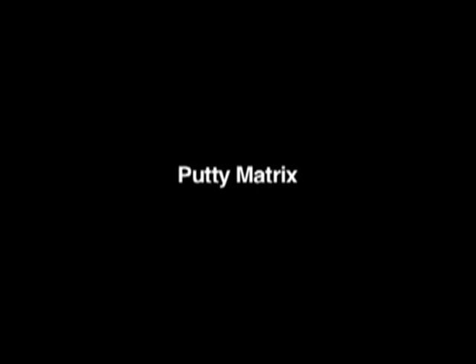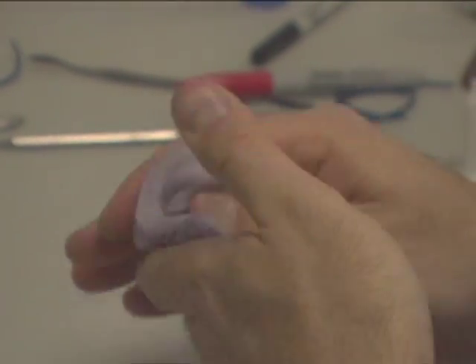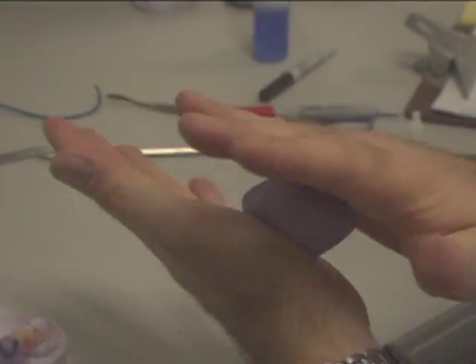Putty Matrix. Mix Sedium Dental Extra Hard Putty. Sedium Dental's putty will give you extra working time over other putties, as well as resistance to heat and strength. Use equal amounts of putty, mixing until there is no marbleizing.